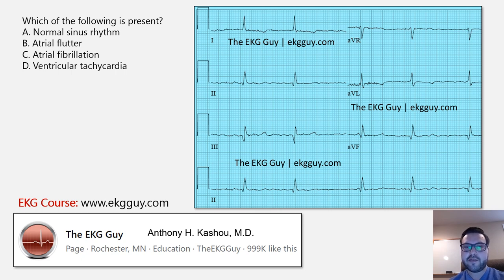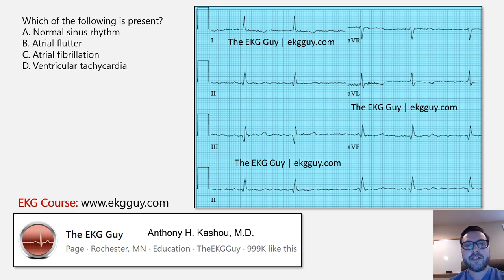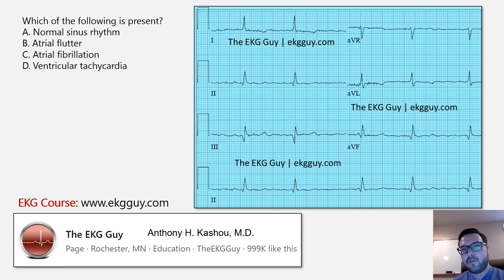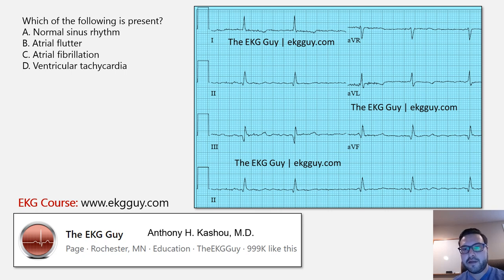You have the limb leads and then somewhat of a rhythm strip. From this, you can interpret the underlying rhythm and differentiate between these four types. That's not always the case with some rhythms, but certainly here you can. One of the first things I'm looking for is where the rhythm is actually originating from, and one of the main things I look at first is the regularity of the rhythm — is it regular or irregular? And if it's irregular, I ask myself: is this a regularly irregular rhythm or an irregularly irregular rhythm?